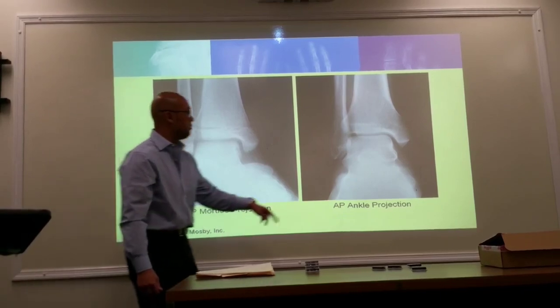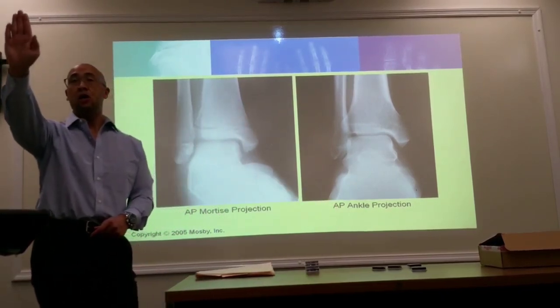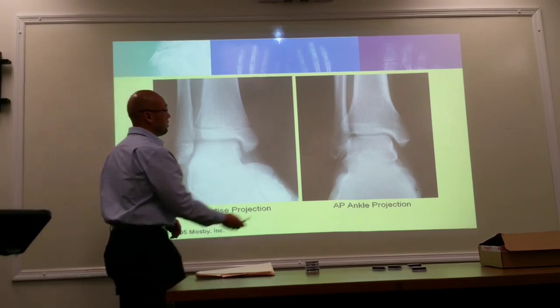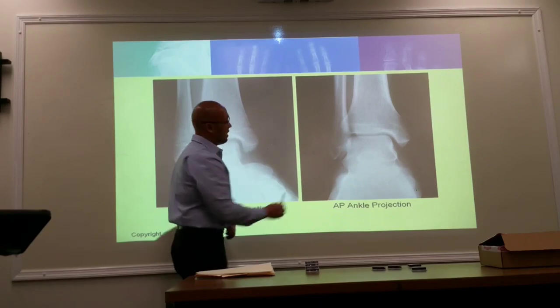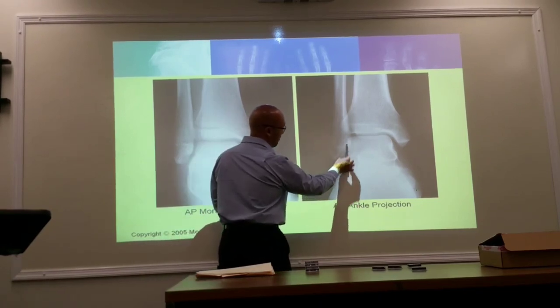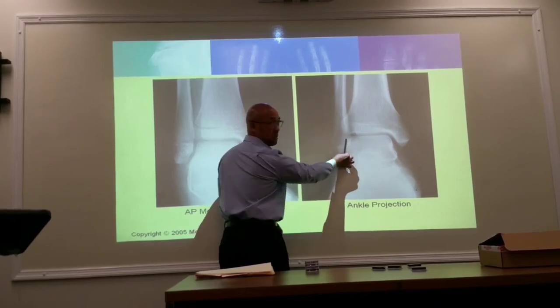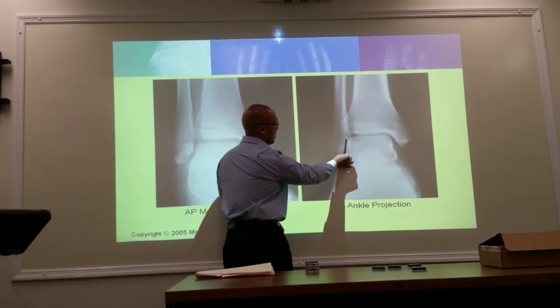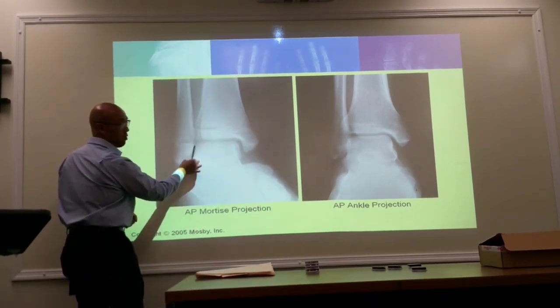This is what it looks like when it's in a true AP. Toes pointing straight up, no rotation. Notice here there's going to be superimposition of the distal tibia and fibula. And then you're not going to see the space between the fibula and the talus. See, this is closed. This is closed. This is closed. This is closed. 15 to 20 degree rotation medially. Now it's open. This is open.